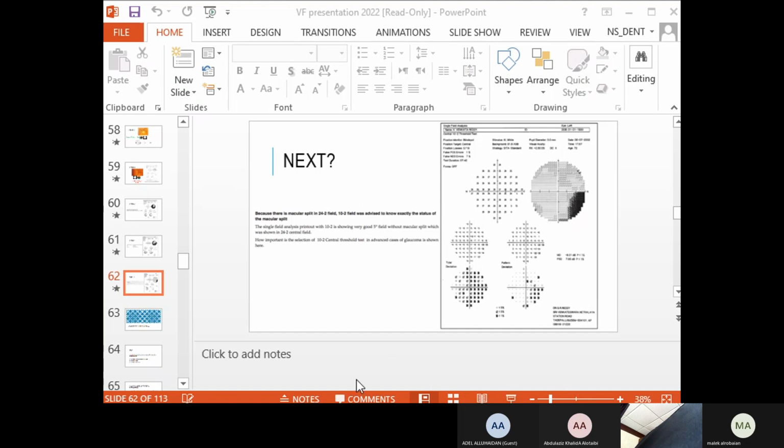So let's see the same scotomas and compare them. He has paracentral here, still there. This one also, a little bit less, but it's still there. But there's something changed. All of this came up. What is this? What do you think? Our peripheral field became more restricted.